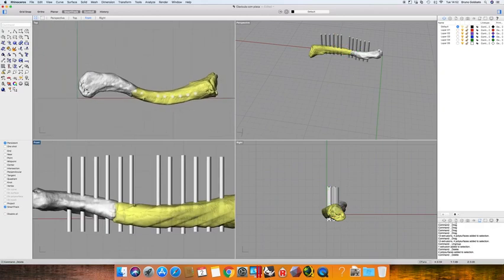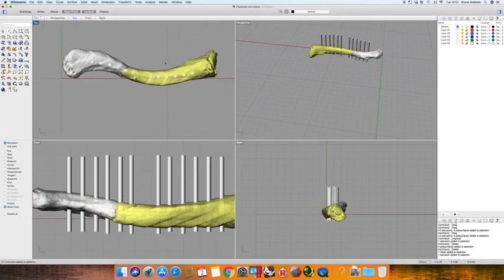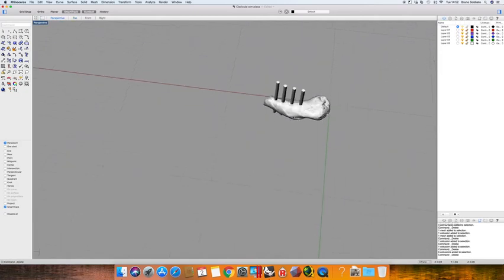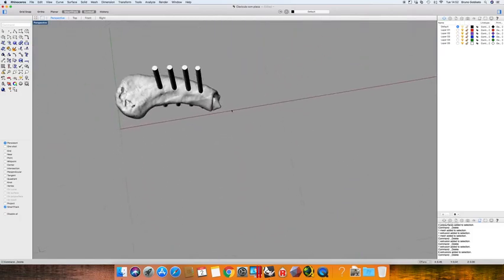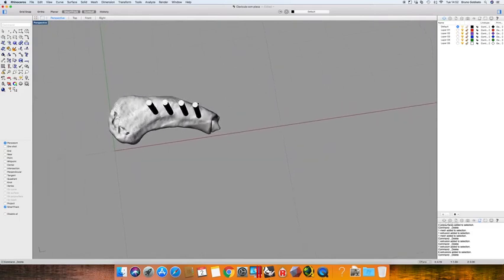So in the surgery, we know that in the lateral fragment, as we can see here, this screw, the fourth screw, will be just like that. So for example, for planning a surgery, you can delete this and have in your OR room just this image, and you make sure that all the screws are in correct position. And if during surgery we open the patient and you drill this in the exact position, we are sure that all the plate will be in exact position.